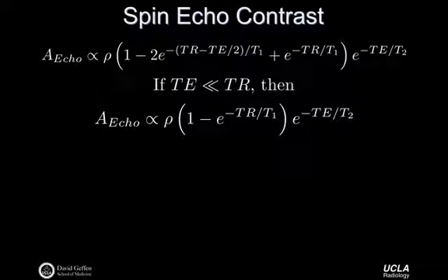So I'll remind you of a couple things then. In the last couple lectures, we've talked about spin echoes, and we've talked about gradient echoes, and we wrote out a lot of things on the board, right? And we finally understood the amplitude of the echo. And by that, we were referring to the amplitude of the transverse magnetization at a specific time, which was the echo time, right? That's what we generally cared to keep track of in the end. So there was a slightly lengthier expression for the amplitude of the echo for the spin echo experiment. But it's usually true that our TE is quite a bit shorter than our TR. TE might be 10 milliseconds, and our TR might be 1,000. So it's a 10 to 1 ratio.